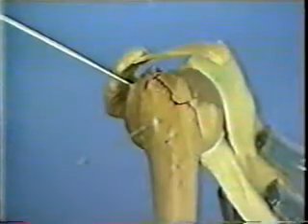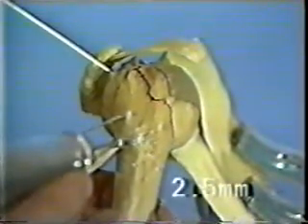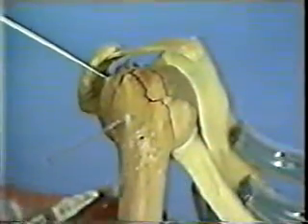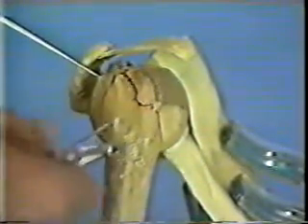To counteract the pull of the rotator cuff, tension band wiring is planned. First, however, we will replace the K-wires by two or more 4-0 cancellous screws with washers, therefore drilling with a 2.5-millimeter drill bit, measuring the length with the depth gauge and tapping with a cancellous tap in the near cortex only.